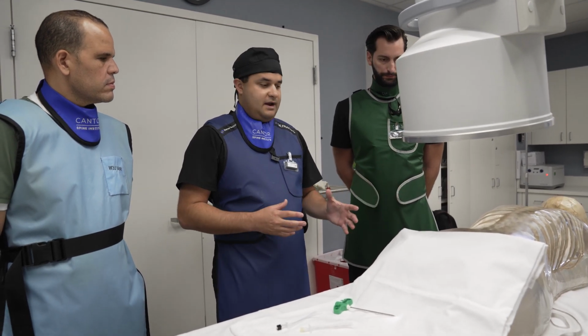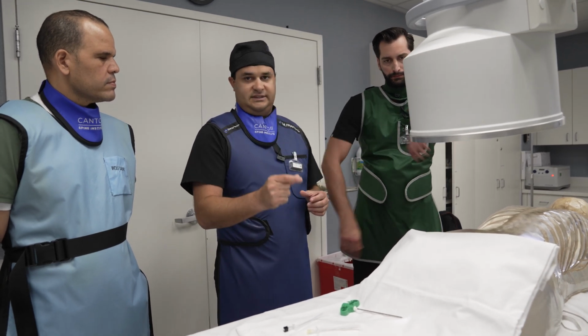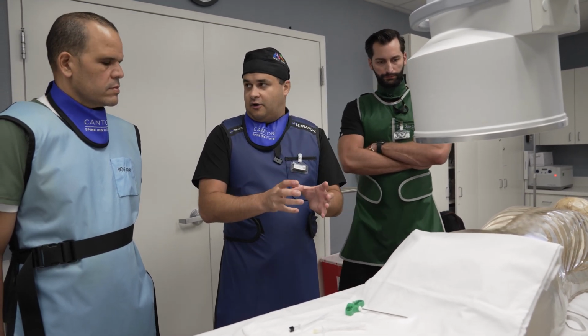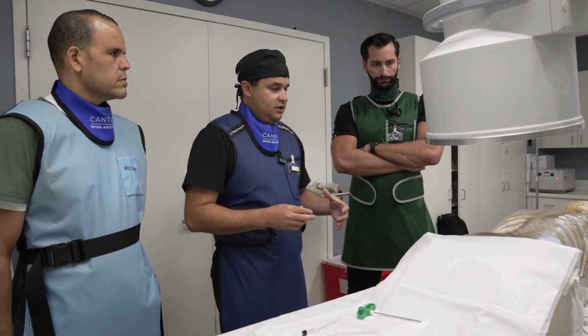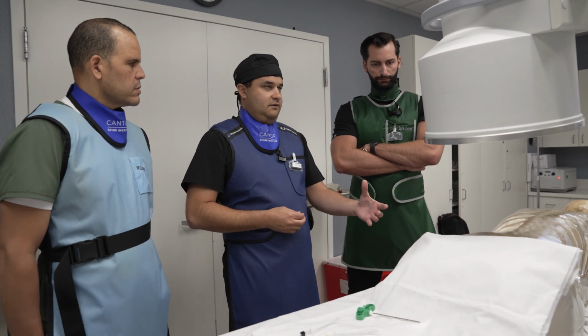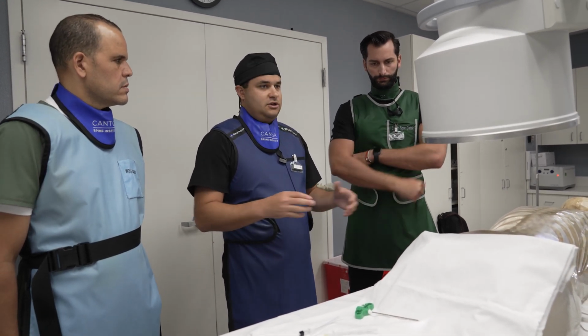When we do a transforaminal, we can really do a small amount of volume, 1 cc of dex and maybe 1 cc of marcaine, and just keep it all in that area. And then you get that diagnostic value out of it, right? So not only are you helping the patient with the therapeutic value of putting the steroid in there, but you're getting that diagnostic value.